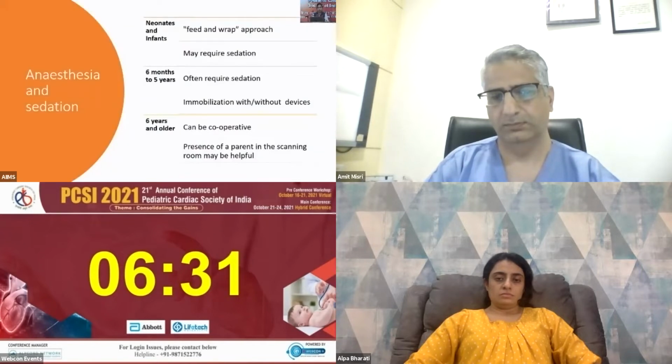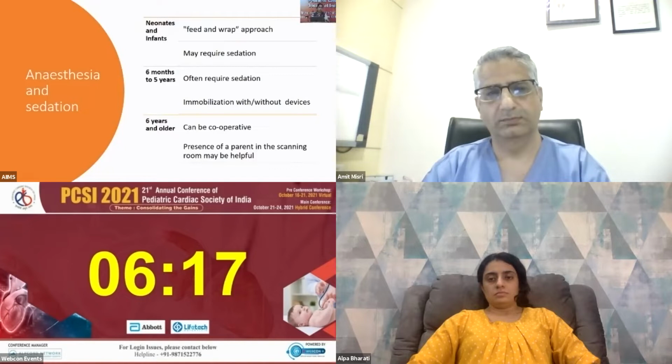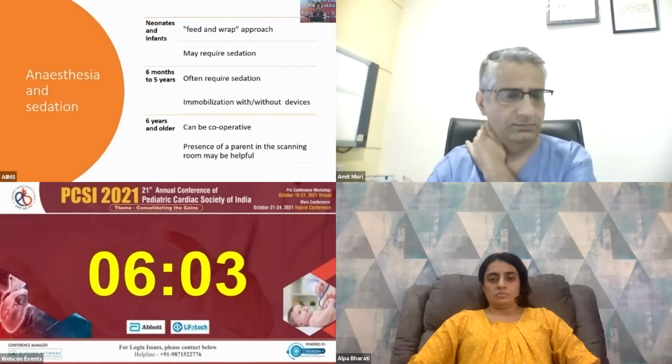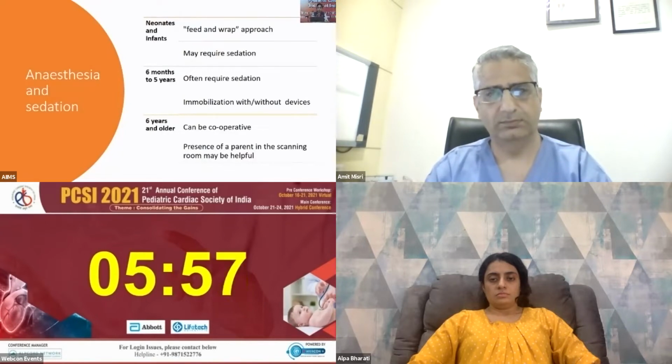So we'll discuss some of them one by one. As far as anesthesia and sedation is concerned, doing a pediatric case anywhere, not even cardiac, is a nightmare. The patient usually will end up crying once you put in the IV line. So at our institute, the patient comes 2 hours prior. Before he is posted, the IV line is put, the patient is soothed, and by the time he is in the console, he is already over the trauma of having undergone that IV line insertion. As far as neonates and infants are concerned, they may require sedation.